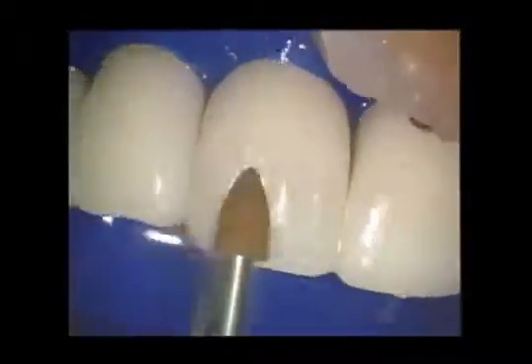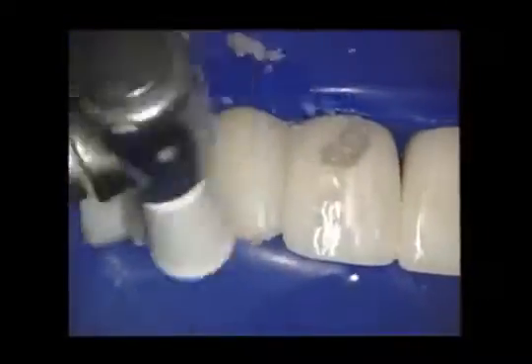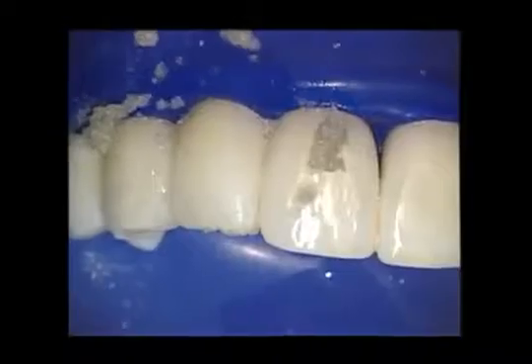So here are the 3 steps. Number 1, we use a brownie. Like I said, about 12,000 RPMs with water. Next thing we use is coarse pumice. That gives us a nice matte finish with omnidirectional scratches. We don't want all the scratches going the same direction.